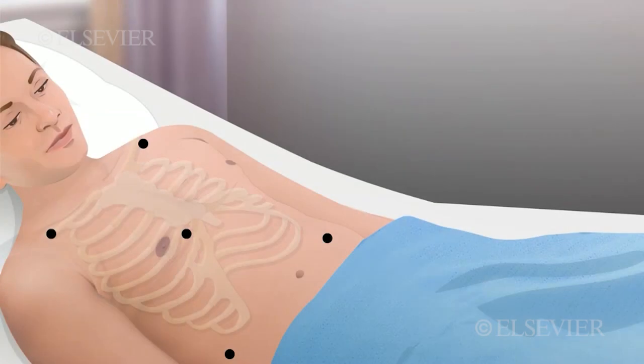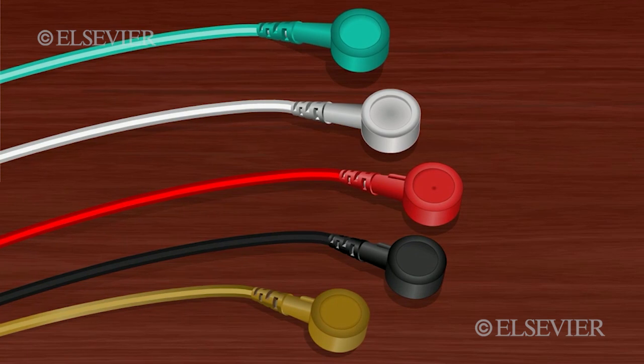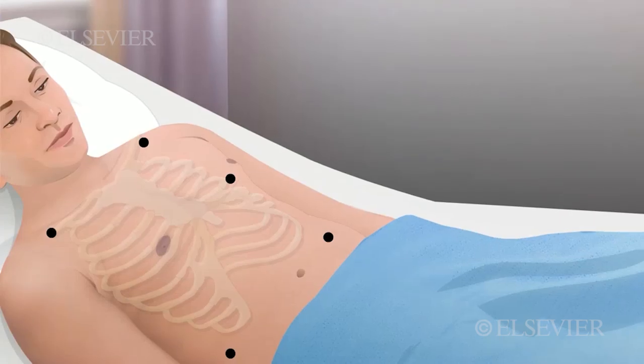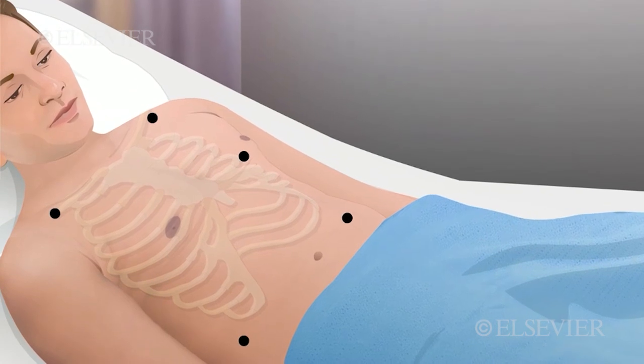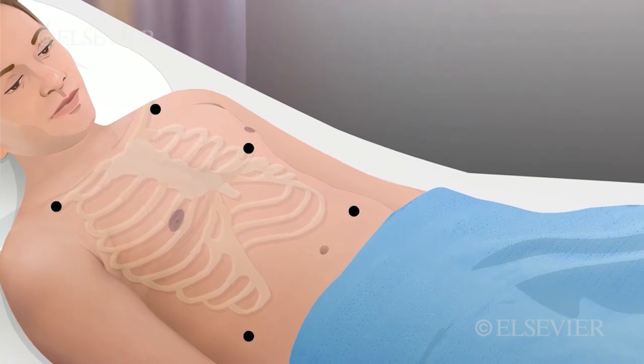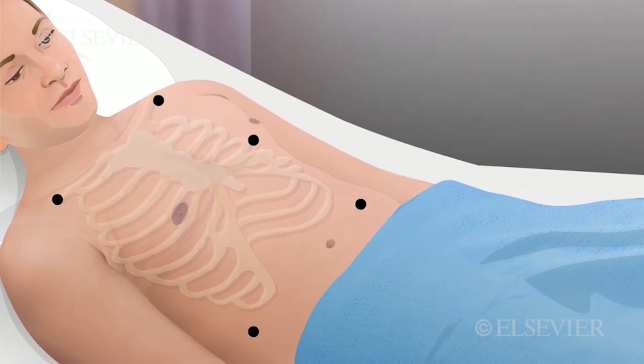When using a 5-lead system, select a lead. Select V1 as the first choice. Substitute V6 for V1 when the patient cannot have an electrode at the sternal border, or when the QRS complex amplitude is not adequate for optimized computerized monitoring.